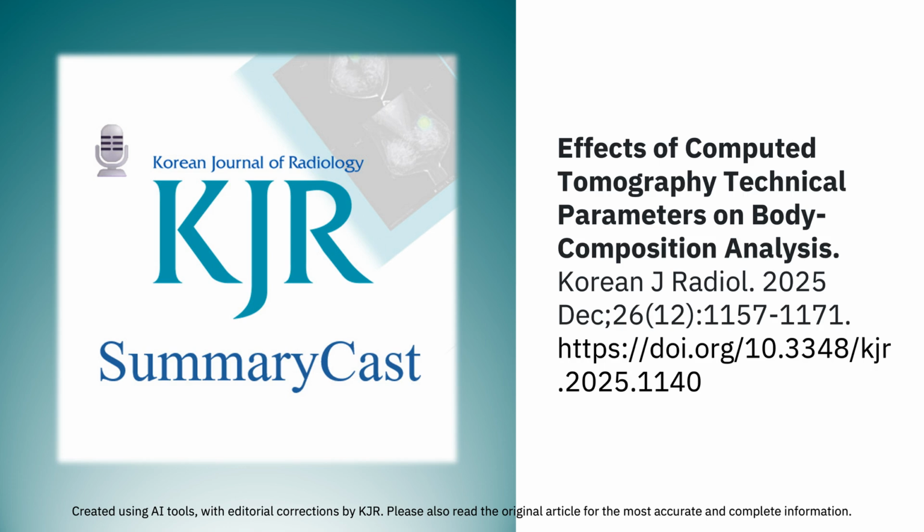Yes, this could involve using a common phantom to calibrate scanners across different sites, or it could involve physics-informed correction schemes that model how attenuation shifts with changes in KV and patient size. And I assume deep learning has a role to play here. A huge one. The authors mentioned deep learning-based harmonization, where an algorithm learns to translate images from one protocol, say a low-dose scan from one vendor, to look like a standard dose scan from a target vendor. It's like a universal translator for CT images. That sounds powerful, but also risky if the model introduces its own artifacts. It's a definite risk, but the goal is to reduce variability and improve the comparability of results.